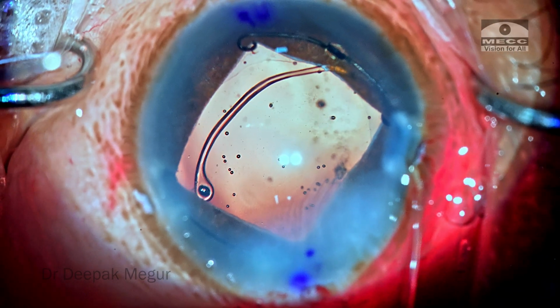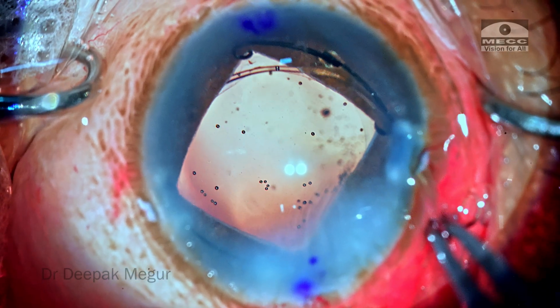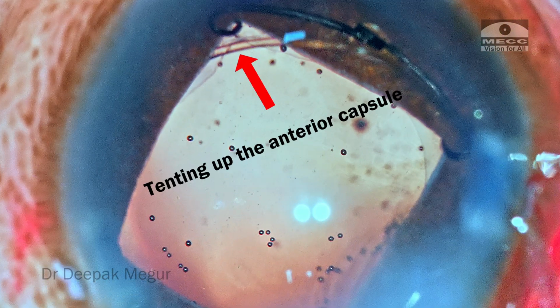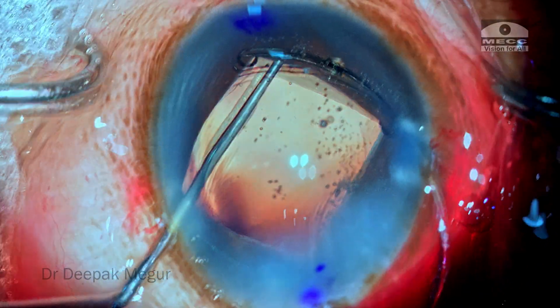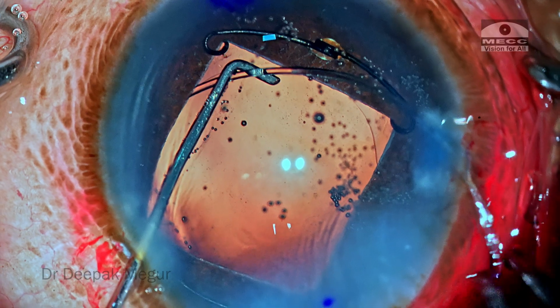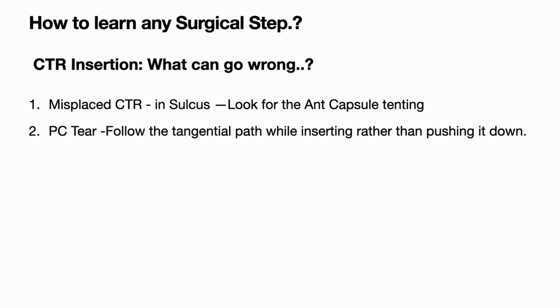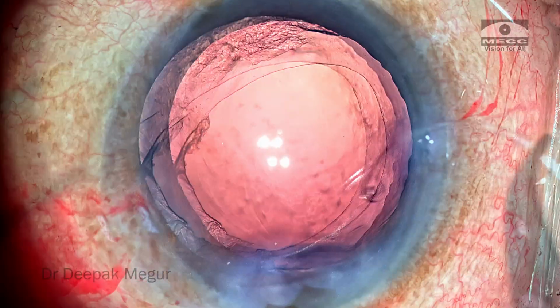But one telltale sign would be to always look at the edge of the anterior capsule where the CTR is going in. There is a small kink which we note at the rhexis margin, and that is a clue that the CTR is truly behind the anterior capsule and not in front. Number 2, how do you prevent the PC tear when you're trying to negotiate the CTR?